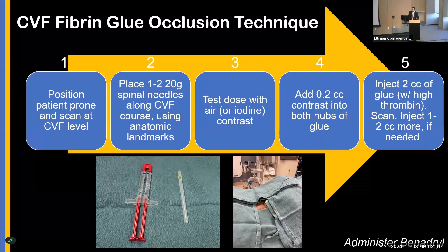Fibrin glue patching has five steps. We position the patient prone and scan at the fistula level under CT. We place one to two 20-gauge needles along the course of the fistula. We do a generous test dose with air. With our fibrin glue, we pull the syringe back and inject a little contrast into both hubs of the glue. Then we inject two cc's right away, do a quick scan check, and inject one to two more cc's. Importantly, we only use fibrin glue with high thrombin content — the low thrombin type is not effective.